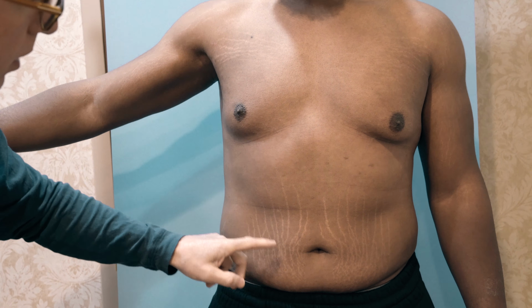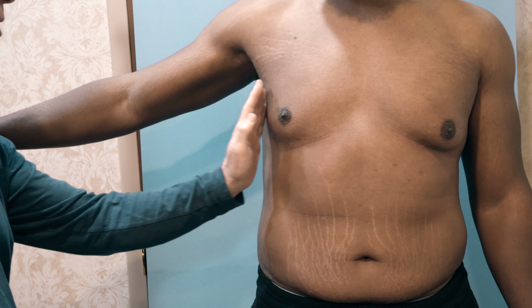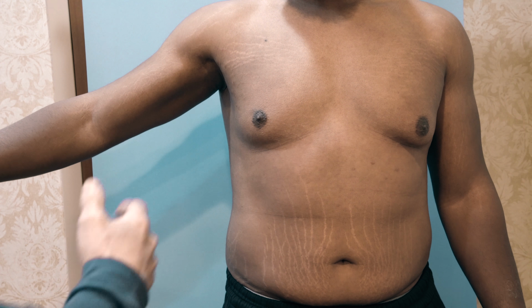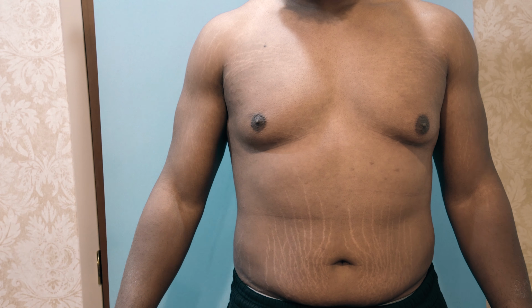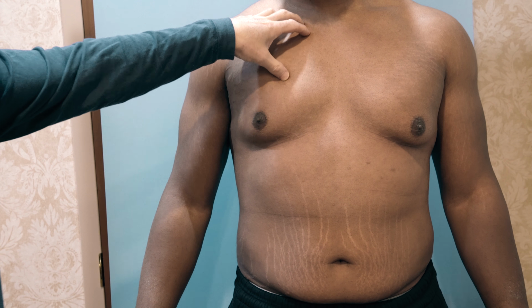1, 2, 3, 4, 5, and 6. He's really got to work on that. Go down to the lats in the back, create this beautiful negative space here. It's all about negative spaces, positive spaces, light. I should one day start to do some injections of the fat up here, but I don't know if people want, like, would you ever want fat to be injected up here?